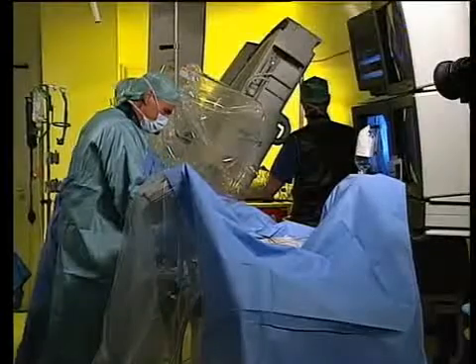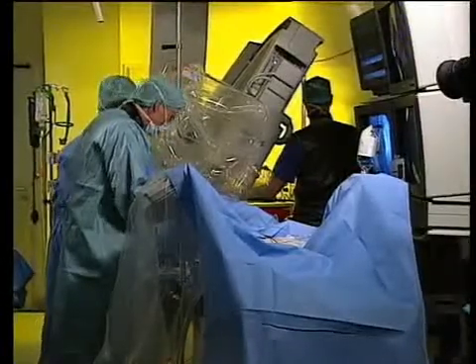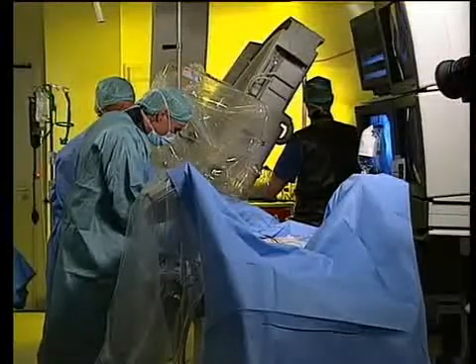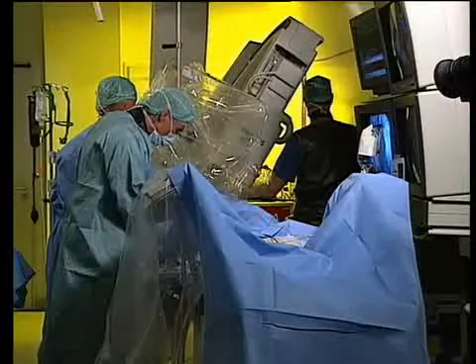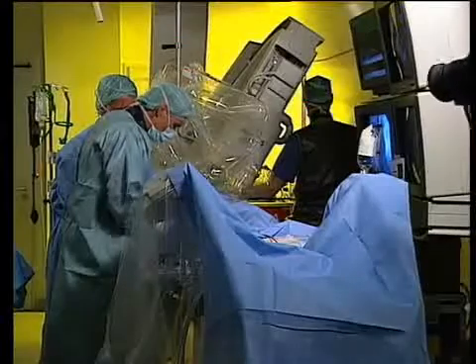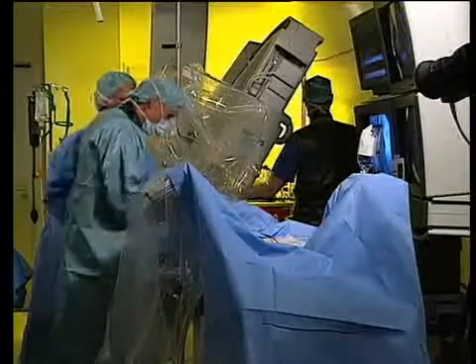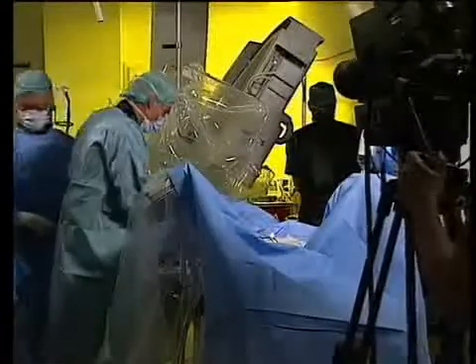Meanwhile, we can have a look at the echo. And what sheath does this go through? This goes through — actually it's here right now — a 10 French sheath, but it goes through a 9 or 8. Very easy.